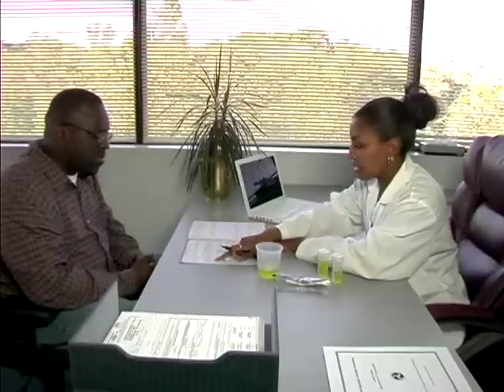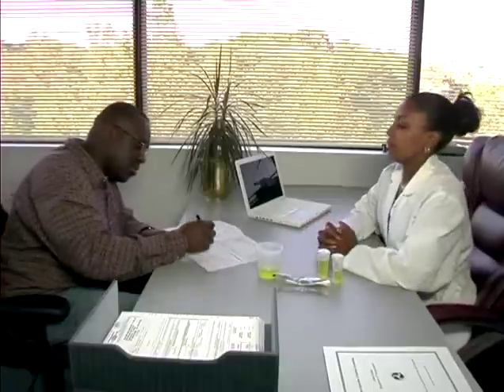Flip to Copy 2 of the CCF so that the employee can complete Step 5. In this step, the employee is asked to provide personal identifying information that must not be on Copy 1, the copy of the CCF that goes to the lab. Have the donor read the certification statement, print his or her name, provide date of birth, daytime and evening telephone numbers, and date of collection, and then sign his or her name. After the donor completes Step 5, review it to make sure that all of the required information was provided.